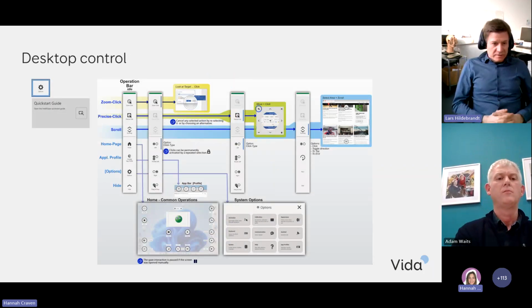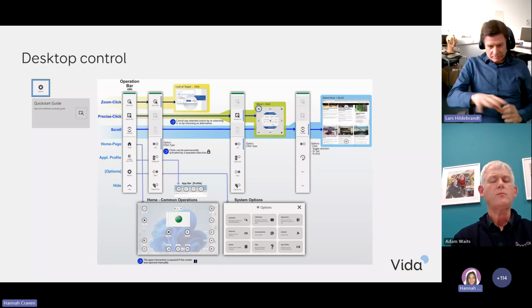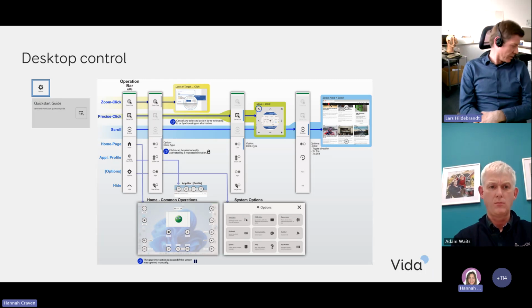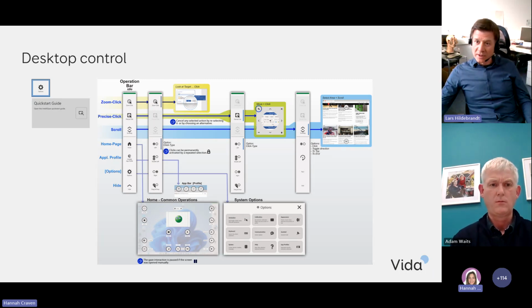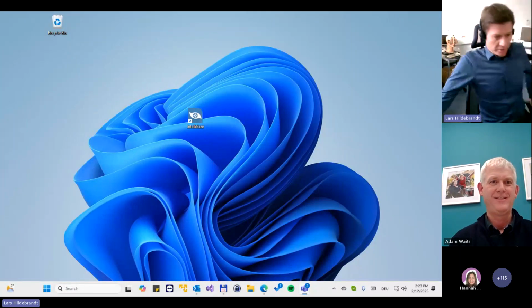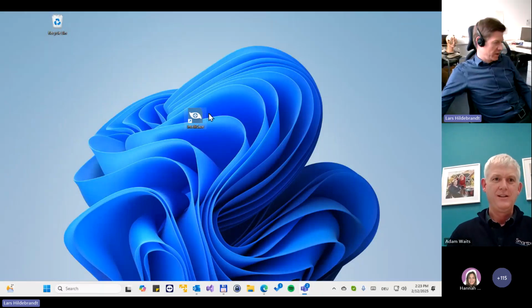Okay, next slide, please. I want to show you the strengths of the desktop control. This slide is just a snapshot of our quick start guide, which you can look at on your own. I don't want to go through every feature here. I just want to stress the most important ones, and therefore I want to share my screen with you to show you the reasons why users want to use IntelliGaze. Assuming you exited grid, then IntelliGaze is either started automatically or you start it manually.